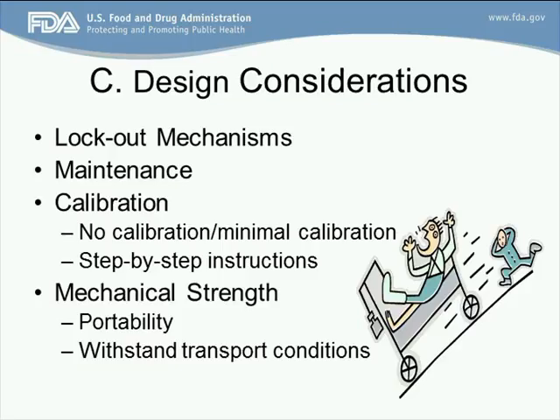In the area of calibration, we prefer no calibration or minimal calibration, understanding that some devices do need to be calibrated. For instance, glucose meters: if you have a new box of test strips, you will want to use the test strip to make sure that it's calibrated to that particular lot number. We prefer that you do have step-by-step instructions if you do have to have a calibration.